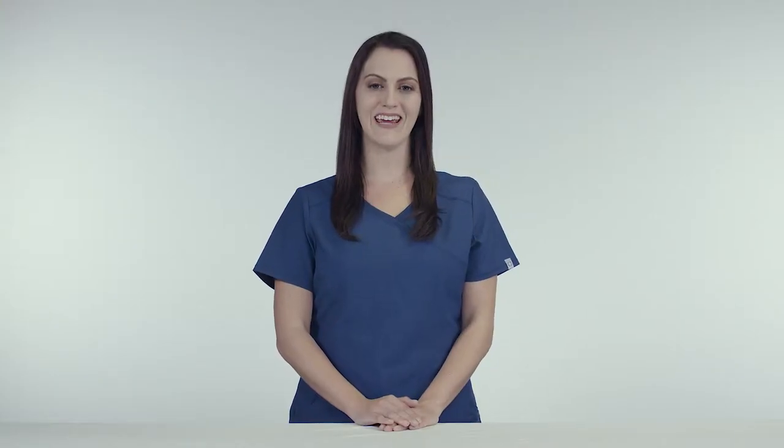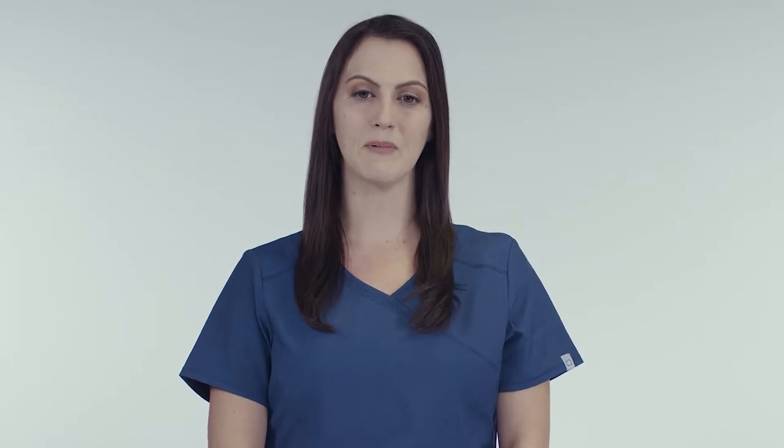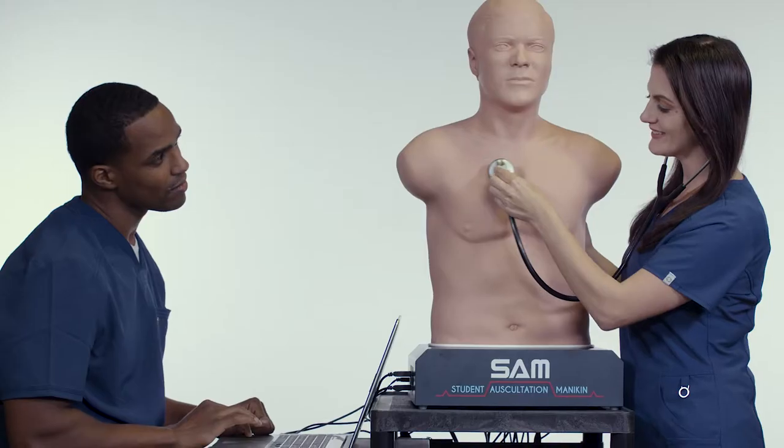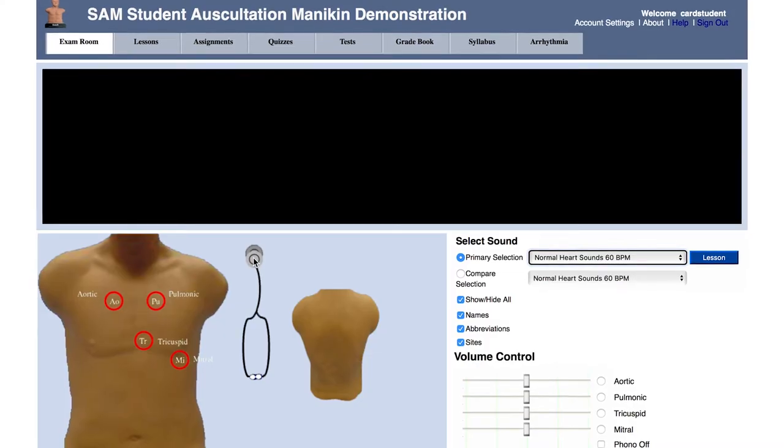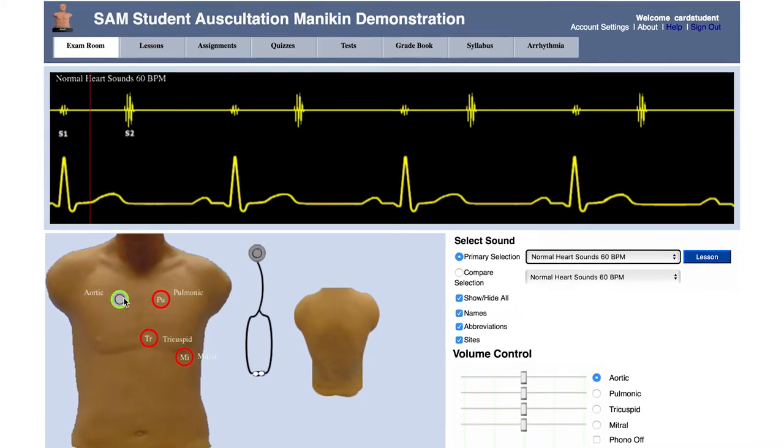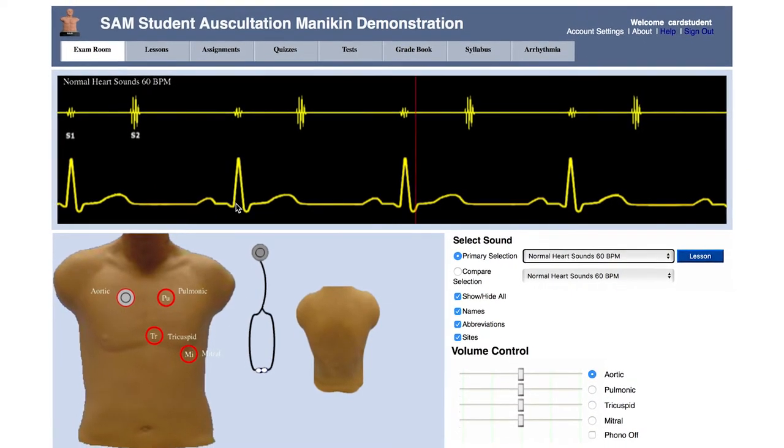SAM Online gives students and instructors access to an extensive simulated sounds library, lesson guides for over 80 conditions, and tools to examine progress 24-7. SAM Online is complimentary for one year to users of SAM 3G, PAT, or the Bionic Hybrid Simulator. It is also available for individual purchase. SAM Online is an essential program for reinforcing the lessons and concepts of auscultation for any academic level.